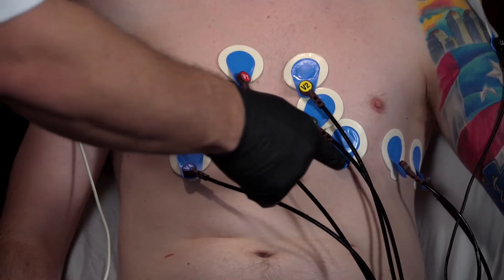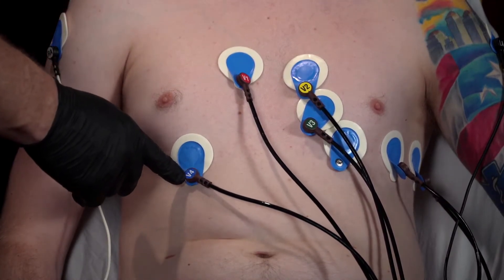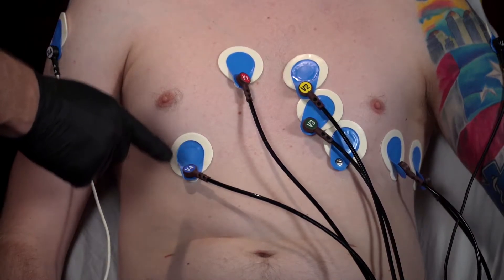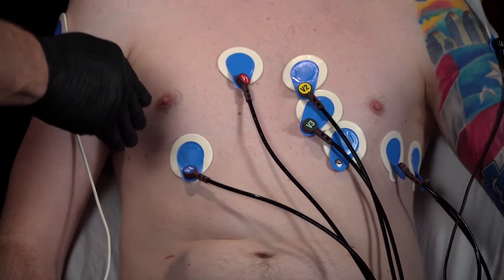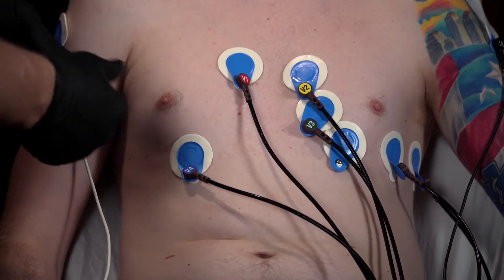We disconnected V4 from the patient's left side and moved it over to the right side. Again, that anatomical location is going to be midclavicular in the fifth intercostal space — this time on the patient's right side. We're calling this V4R.